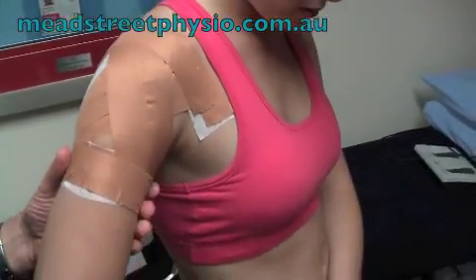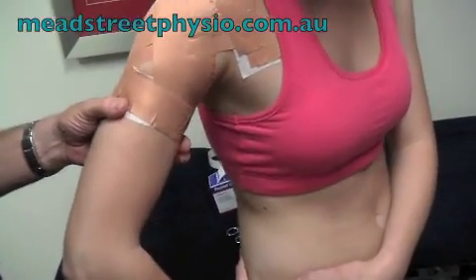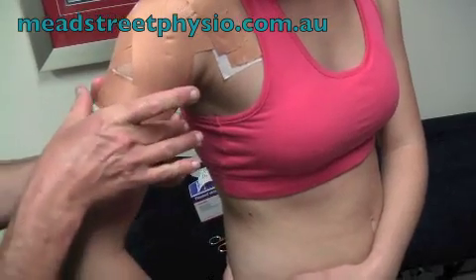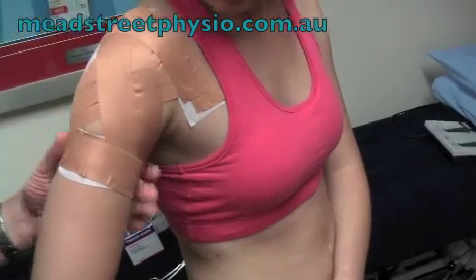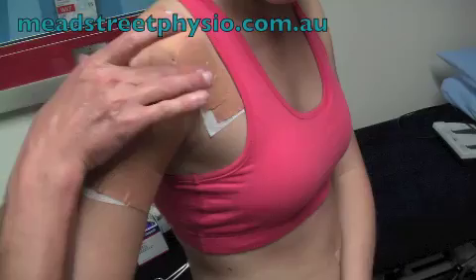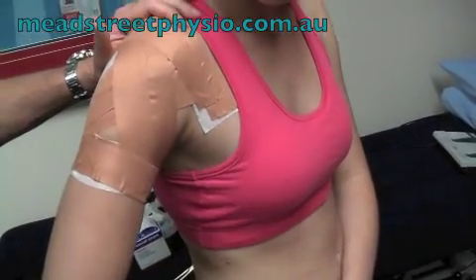Sometimes you can get the athletes to squeeze their muscle a little bit prior to taping it, so that allows the muscles to expand, so that when they're using their muscles, that's not going to create a tourniquet effect. So that's essentially a very simple way of stopping a lot of unwanted forward movement of Jess's shoulder.